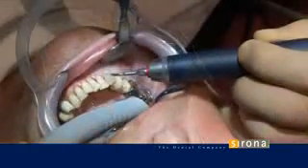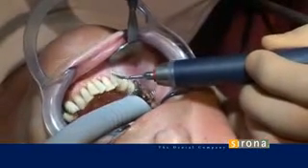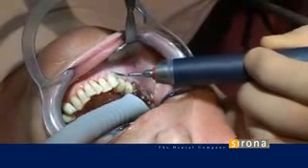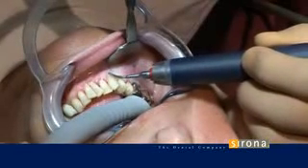You can see very clearly how the calculus is being removed. Here you can see the horizontal movement very well on the visible neck of the tooth.